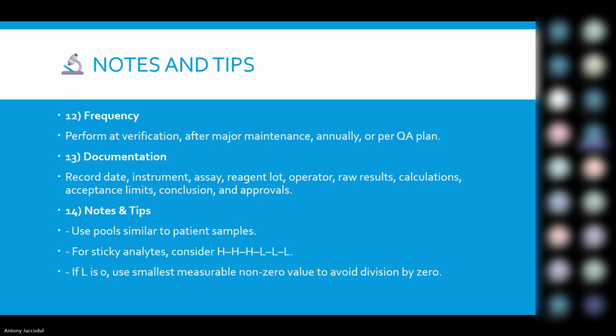Notes and tips. What is the frequency of doing carryover? Perform at method verification. Perform after major maintenance. Perform it annually. Or if you have a quality assurance plan or a quality management plan, you need to perform it according to that particular plan.